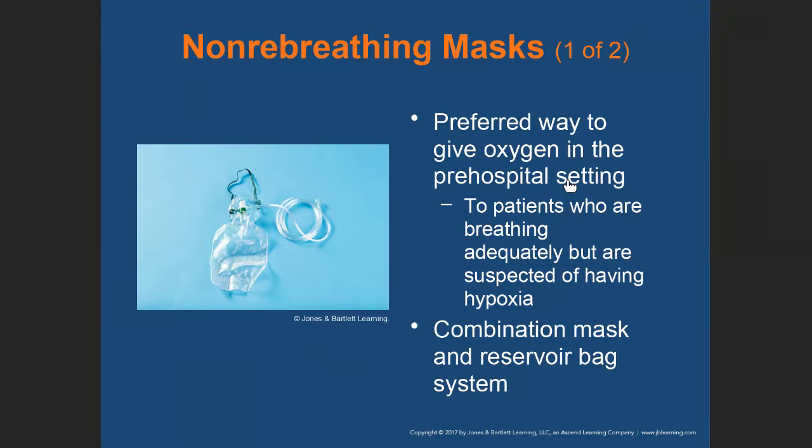The partial rebreather, one of the openings has no valve. So one area has valves that seal that area, but another area, the valve is absent. So the partial rebreather is giving oxygen, but it mixes with the outside air, which is important for some patients.